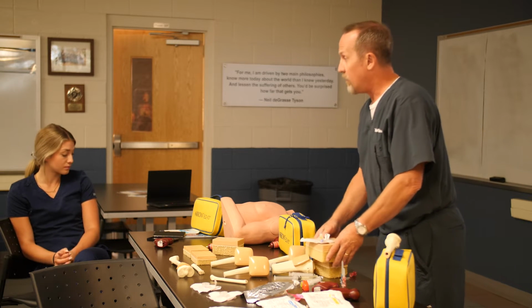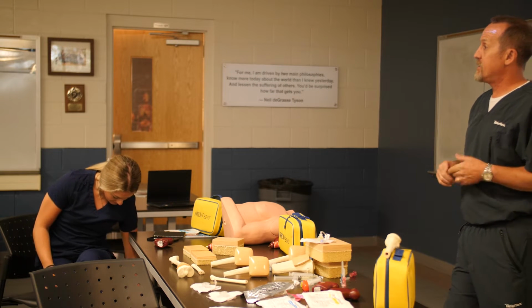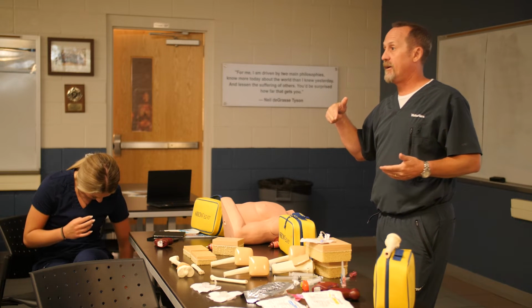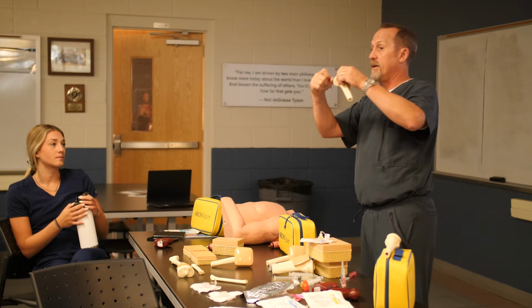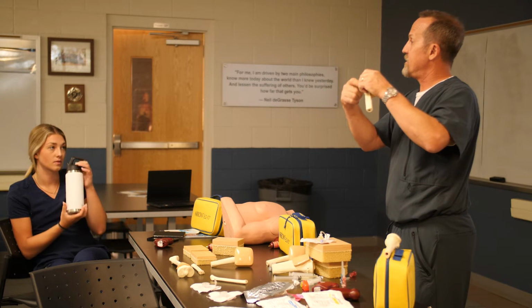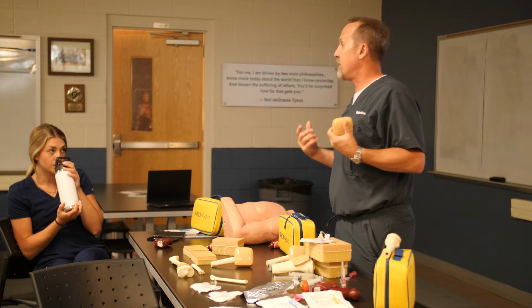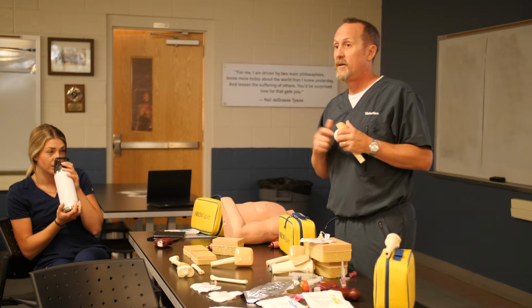Okay? So, going to the point that he made, when you flush, so I was talking about the pain threshold. When we put it into the skin, it's going to feel like a pinprick. When we drill into the cortical bone, there's no nerve endings in that cortex. So when we drill through the bone, it's not going to hurt. Okay? They're going to feel that pinprick. That's what they're going to feel. They're not going to feel anything drilling into the actual cortex.